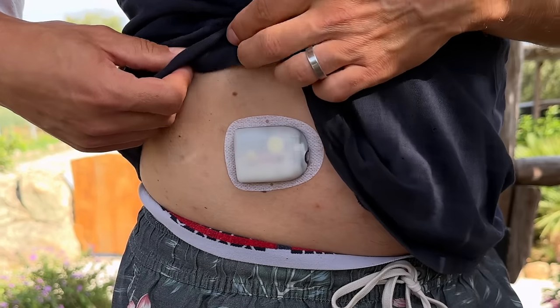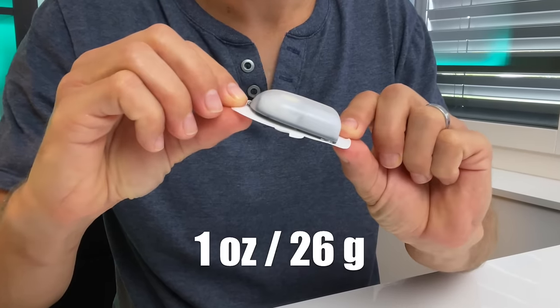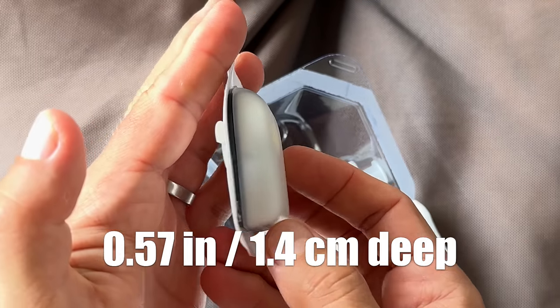The Omnipod 5 is a completely different animal because it's a tubeless patch pump. It's a lot smaller and lighter — less than one ounce or 26 grams — and it's about 1.5 inches long, 2 inches wide, and 0.6 inches deep.